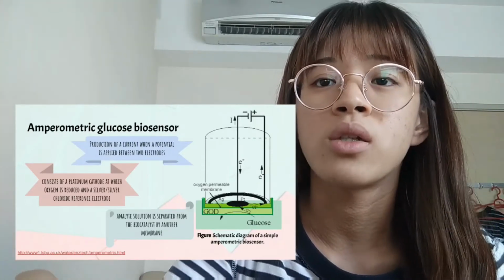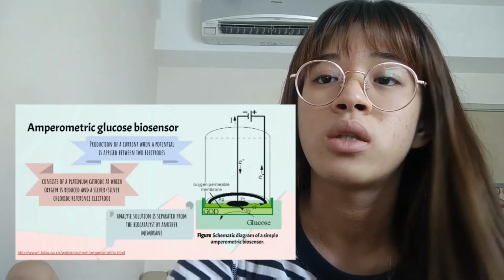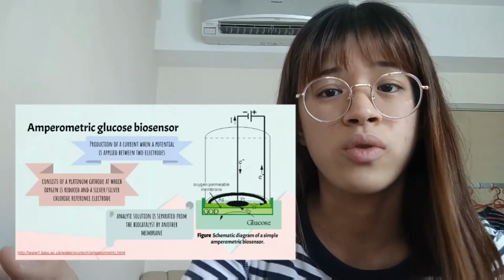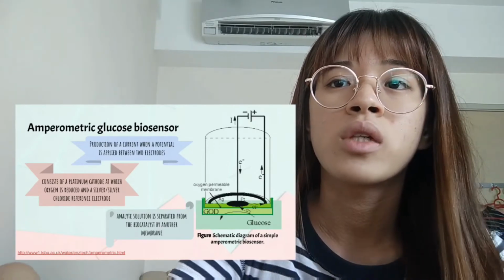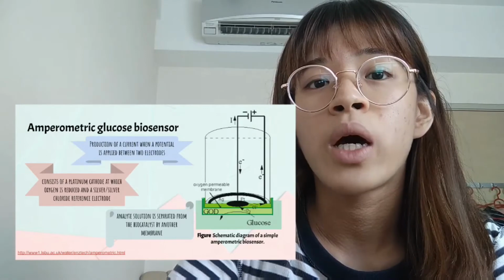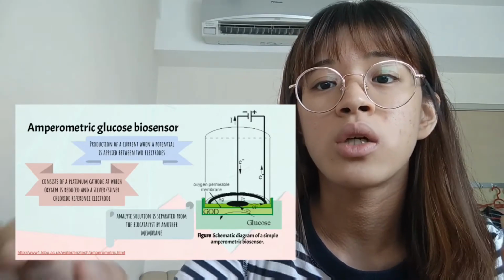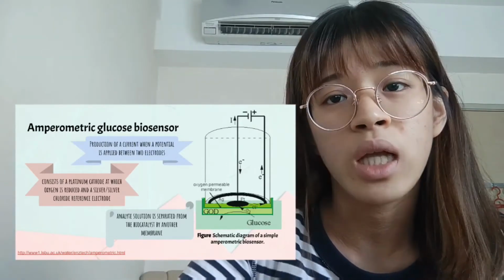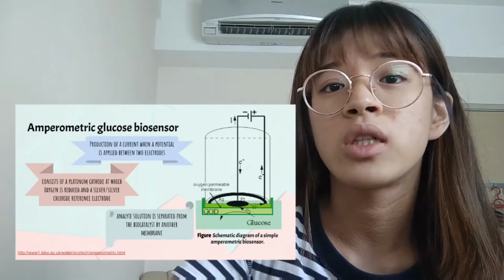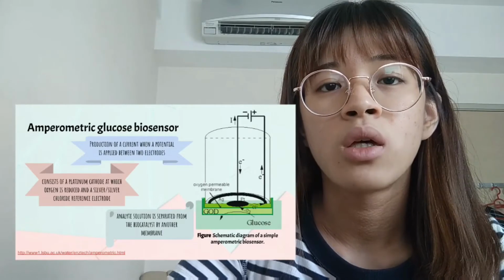This glucose biosensor is actually the most common device that is commercially available and widely studied over a few decades. The amperometric sensors are used to monitor the current generated when the electrons are exchanged either directly or indirectly between the biological system and the electrode.